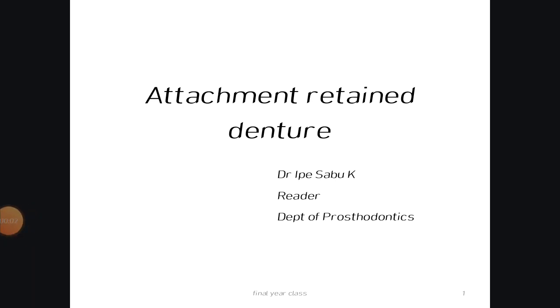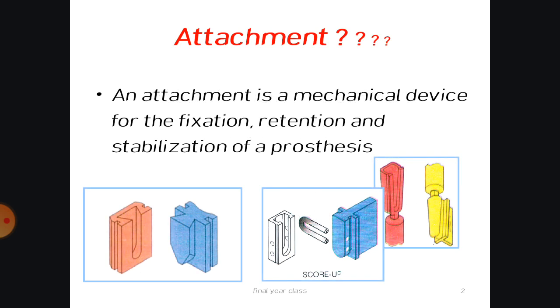Welcome all for today's interactive session on attachment retained denture. We will see what is attachment retained denture, or what is an attachment.